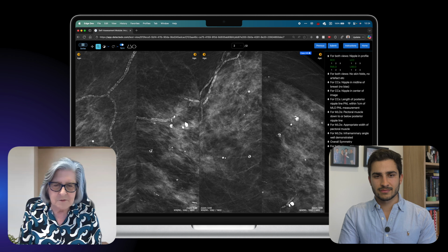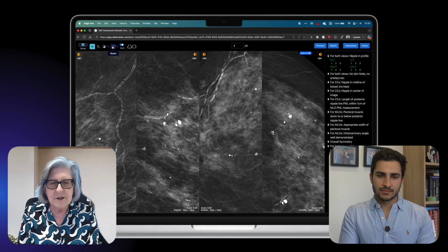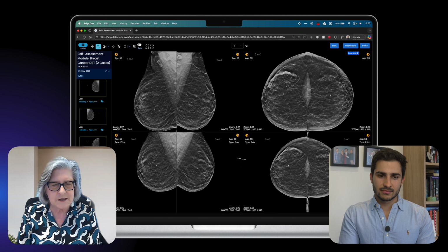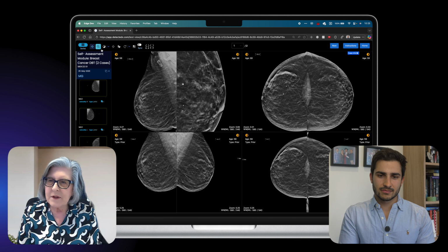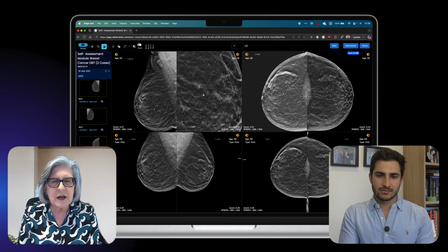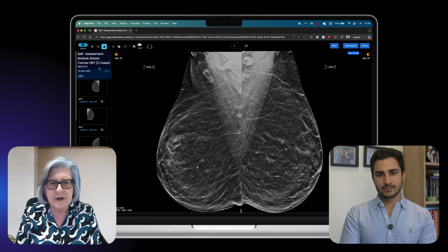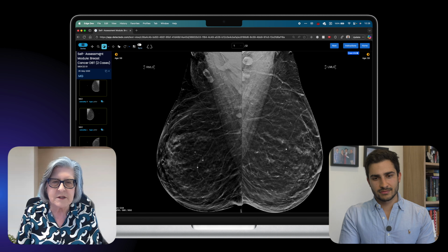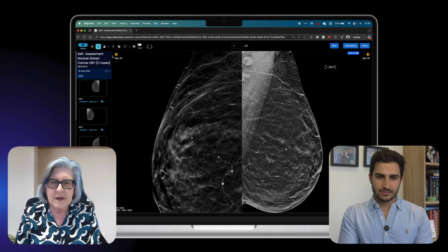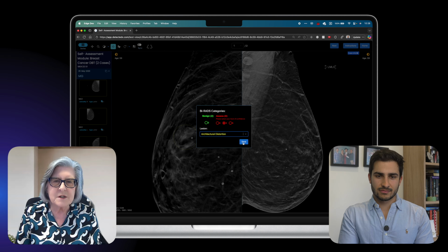The platform itself is actually like an online PACS system with all the usual PACS tech tools, that allow us normally to manipulate images, see things as we might want to. But it's also coupled with an interactive ability to capture information, the interaction that the user has with the platform. So it's these two combined features that allow it to be used for learners, for teachers, for management to do with breast imaging.